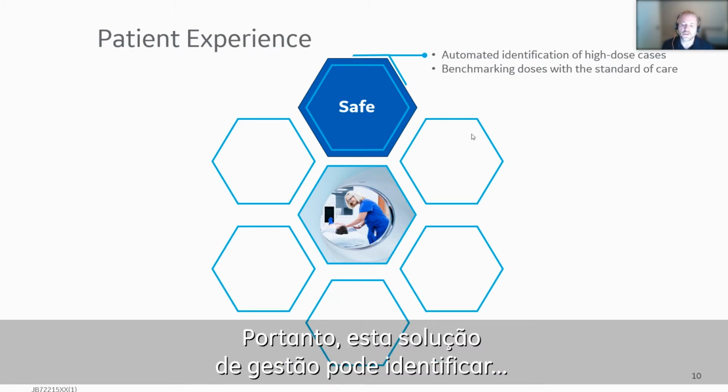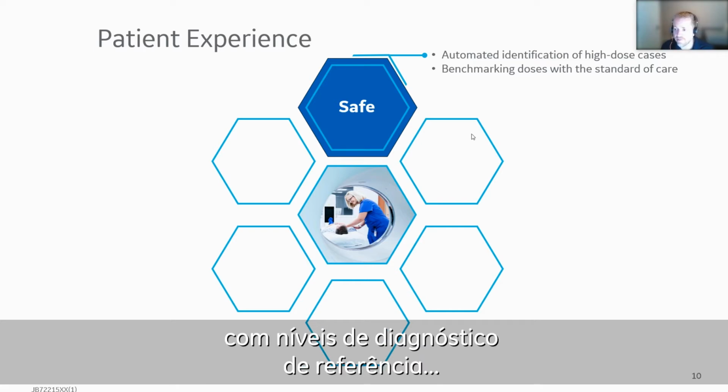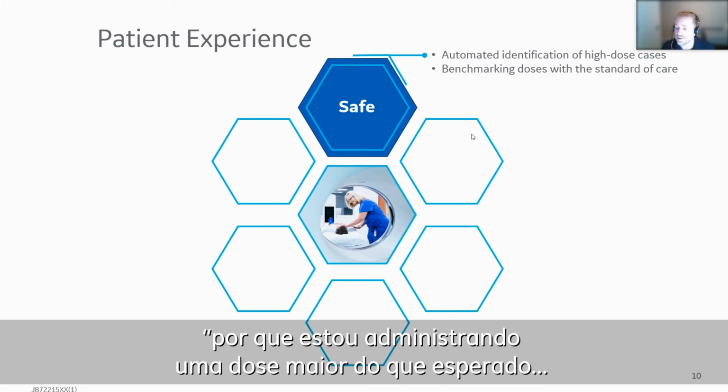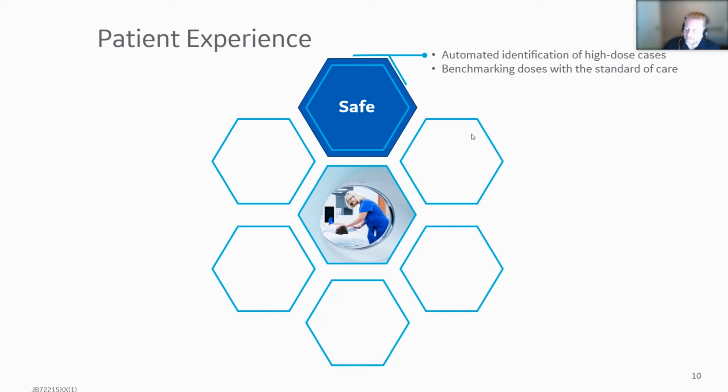So a dose management solution can automatically identify high dose cases, and it can help you benchmark your performance against diagnostic reference levels, against the standard of care. So you know, do I need to reduce the dose somehow in my head CTs, right? Because I'm giving more dose than is expected based on the work of all my peers across the country.